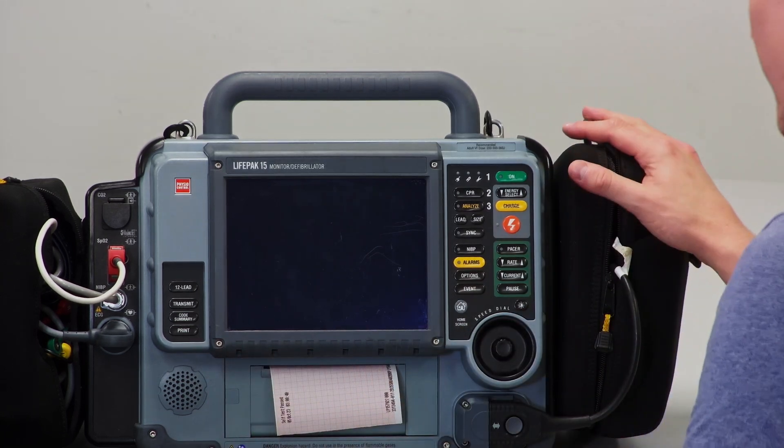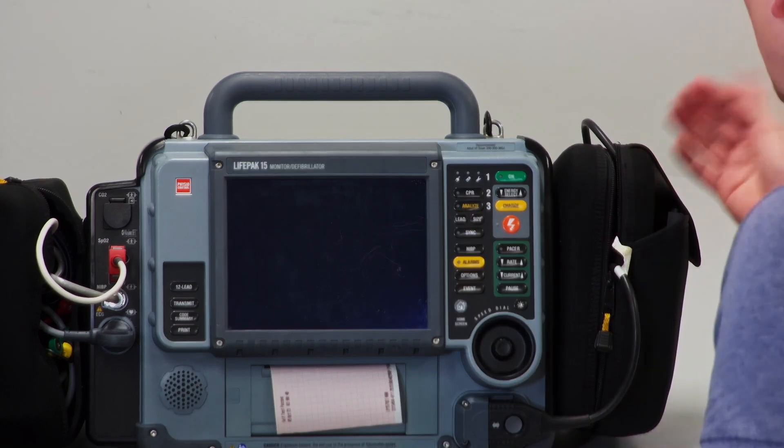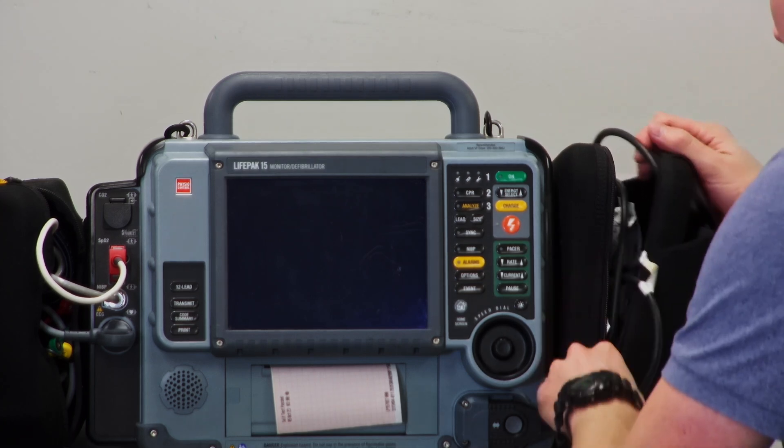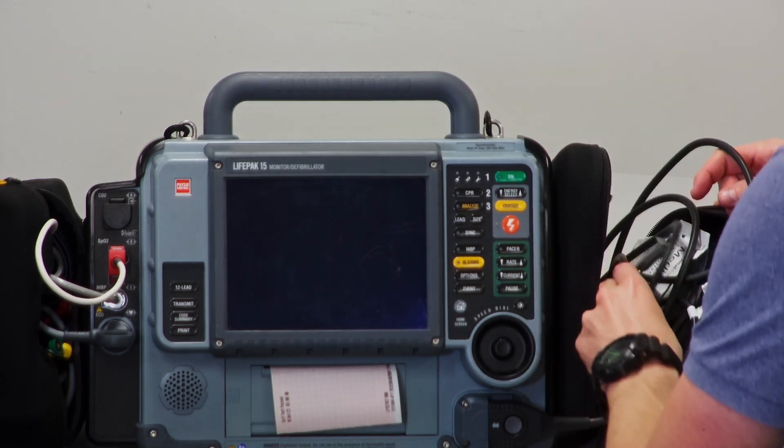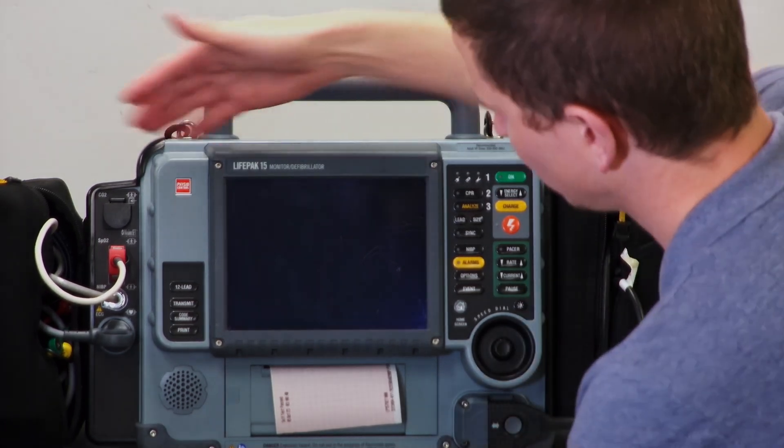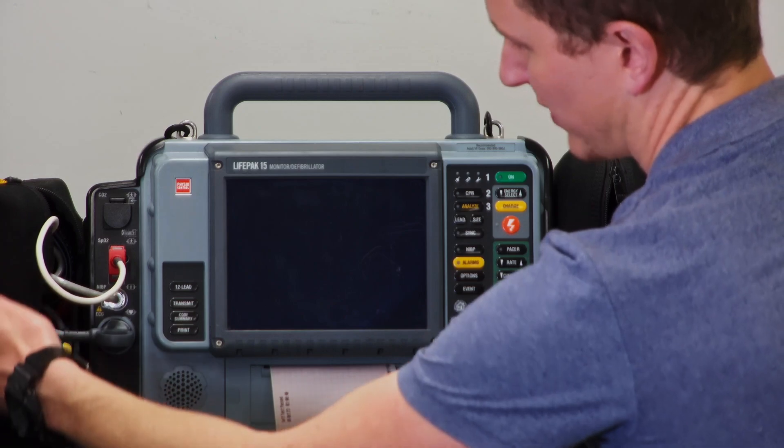On my right, or on the machine's left, are the pads and all those cables—whether you're looking for your pediatric pads, your adult pads, or your connector for the pads, that's where you'll find them. On the machine's right, or my left, are all your vital signs: your BP cuffs, SATs probe, and ECG leads.